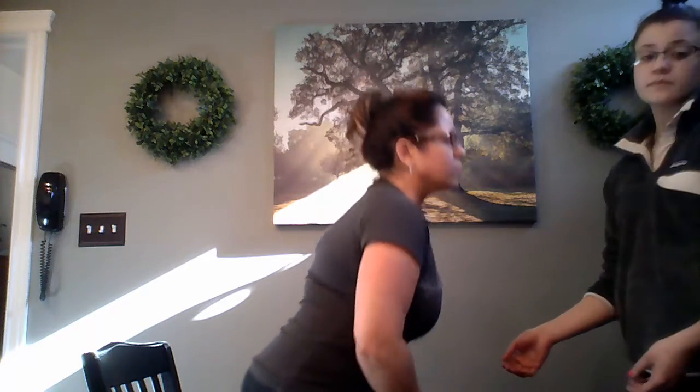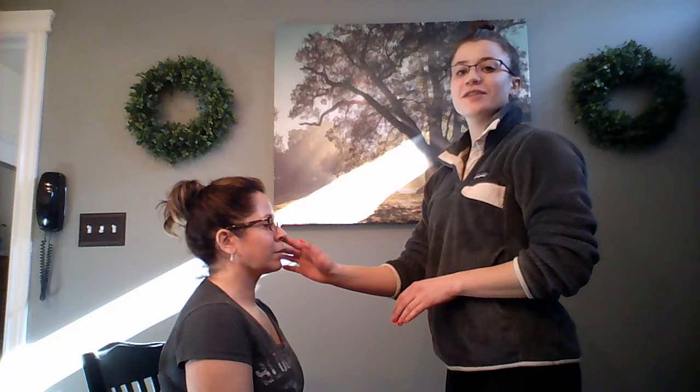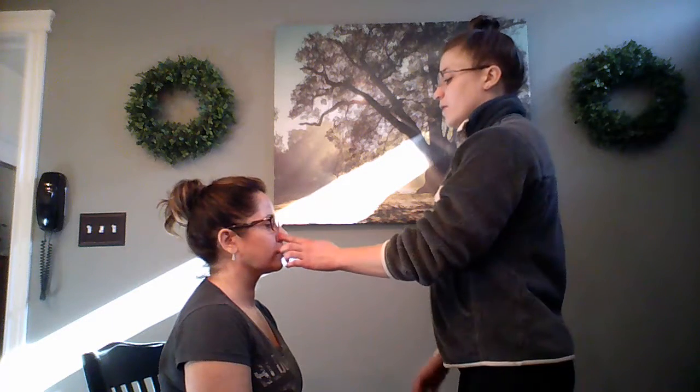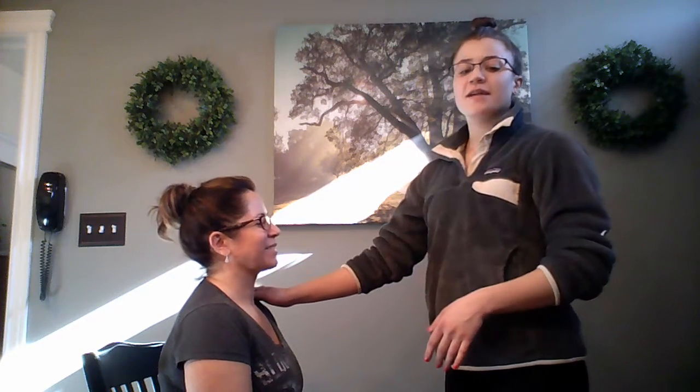You can sit down. Next, we're going to do the nose assessment. Looking at the patient, you're going to assess the symmetry of the nose, noting its midline on the face and proportional to the facial features the patient has. Next, we're going to assess the patency of the nostrils, closing one nostril at a time, having the patient blow out, and then the other nostril, having the patient blow out. Then we're going to inspect the nasal cavity with the otoscope, noting any swelling, discharge, bleeding, or foreign bodies in the nose. You're then going to palpate the sinus area.